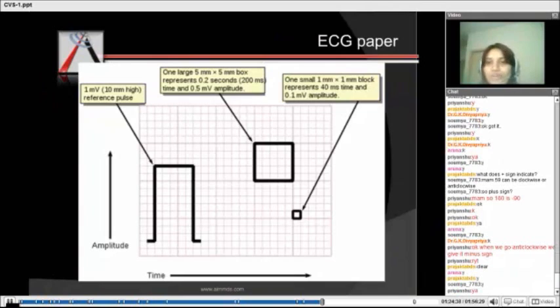Great. Okay, we were talking about our ECG paper. In ECG paper, this is a total 1 inch block. When we say 1 inch, it's approximately 2.5 centimeters. Right? So, one large block is divided into these large blocks and there are these smaller blocks. So what exactly we measure is on this horizontal side. When we go on the horizontal side, what we count is vertical lines.